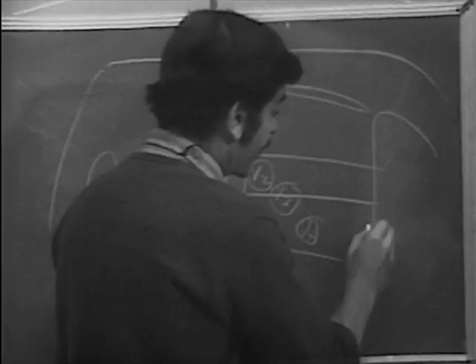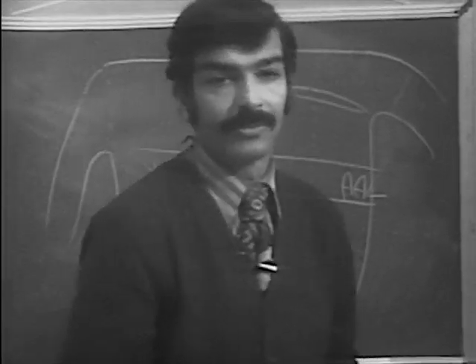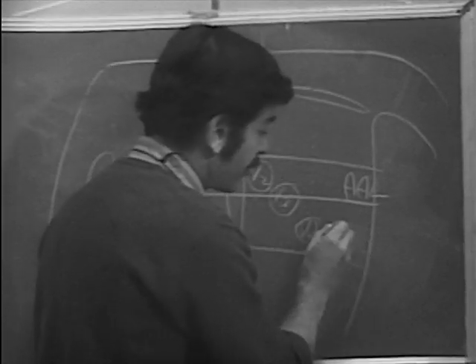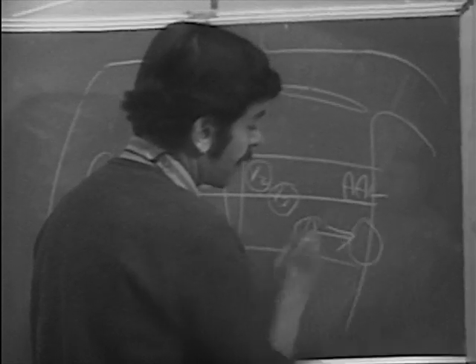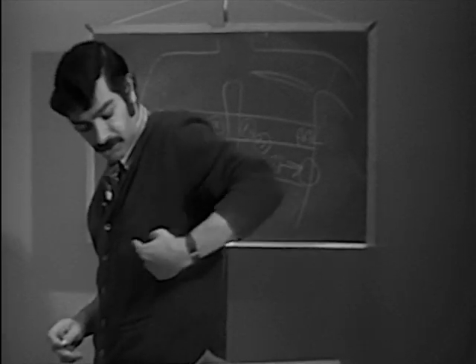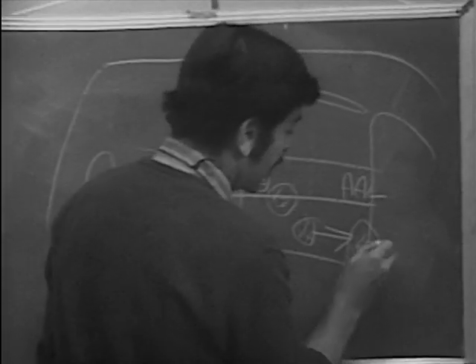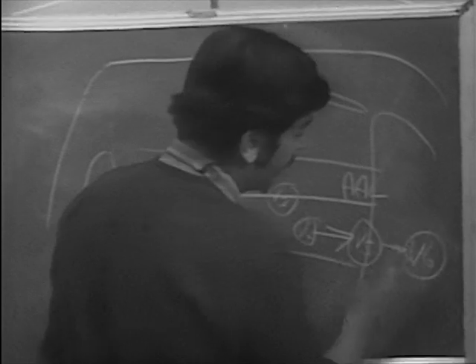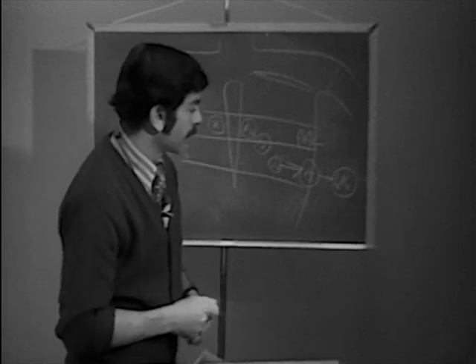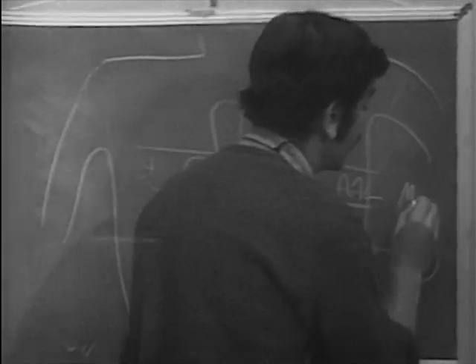V5 goes in the anterior axillary line. In which interspace? No, it doesn't go in any interspace. What you do is you go out in a straight line, because you see the ribs are curving around. You go out in a straight line laterally when you're recording V5, and the same thing for V6. This is the mistake that people commonly make. They curve around the interspace. So this is in the anterior axillary line, and V6 is in the mid-axillary line.